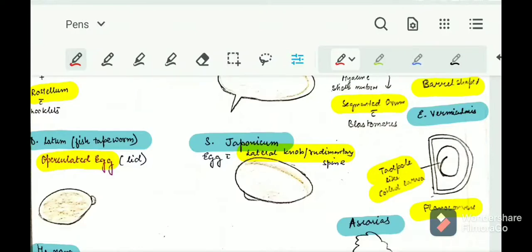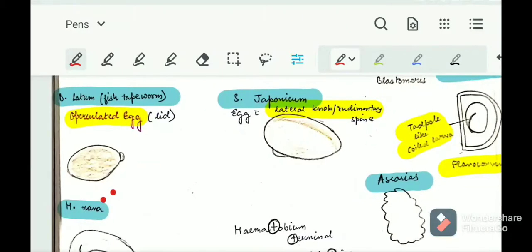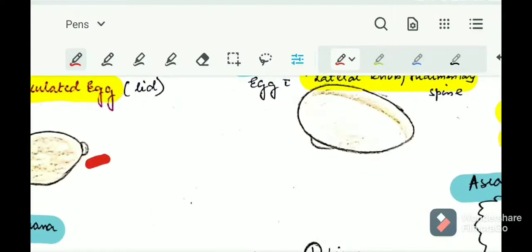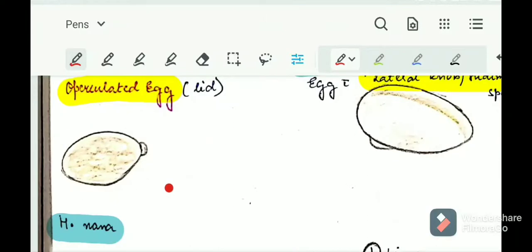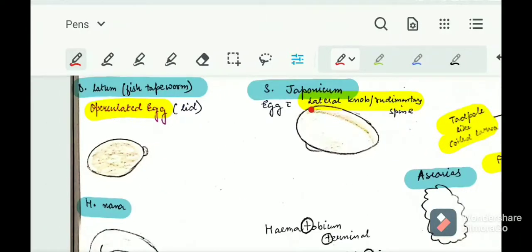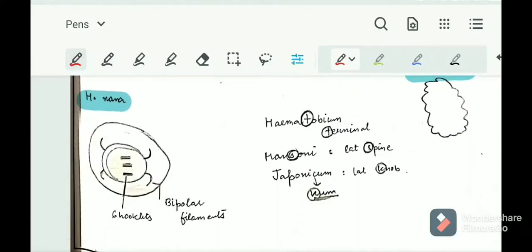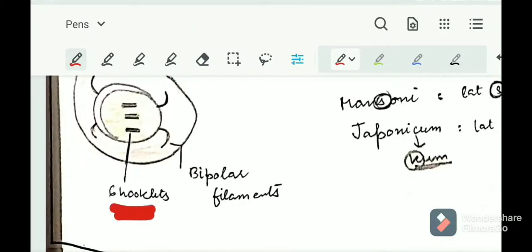Next is Diphyllobothrium latum, the fish tapeworm. This will have an operculated egg. Operculated means having a lid — you can see the lid on the egg. So if we find an operculated egg, it belongs to the fish tapeworm.